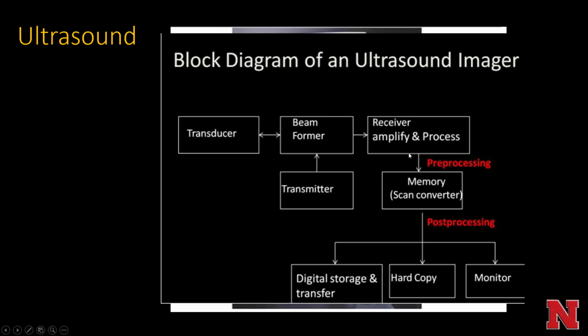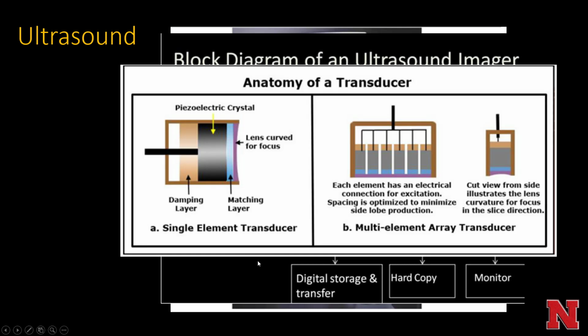And then it goes into a computer where it receives that electronic signal, which is made from the piezoelectric crystal being deformed via changes in pressure and changing that into an electrical impulse. And via a bunch of computer magic, all of that electrical impulse is turned into a picture, which then can be displayed on a monitor or sent out on a hard copy disk somewhere.